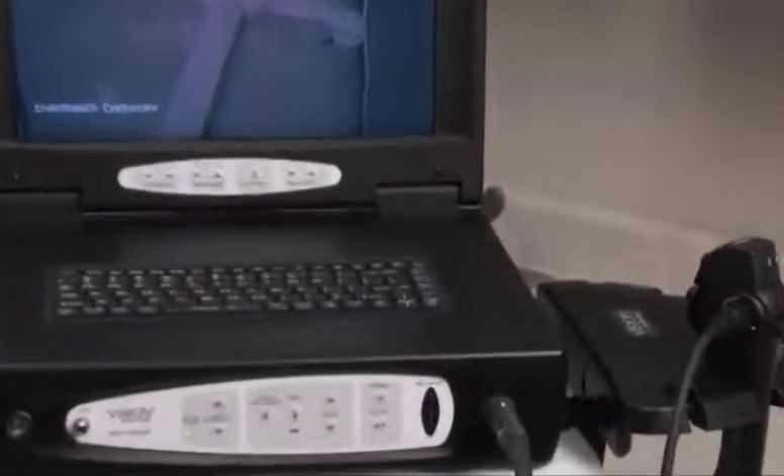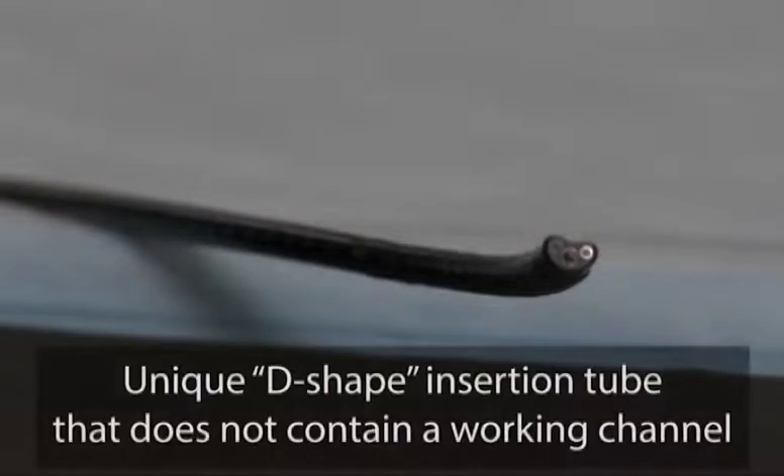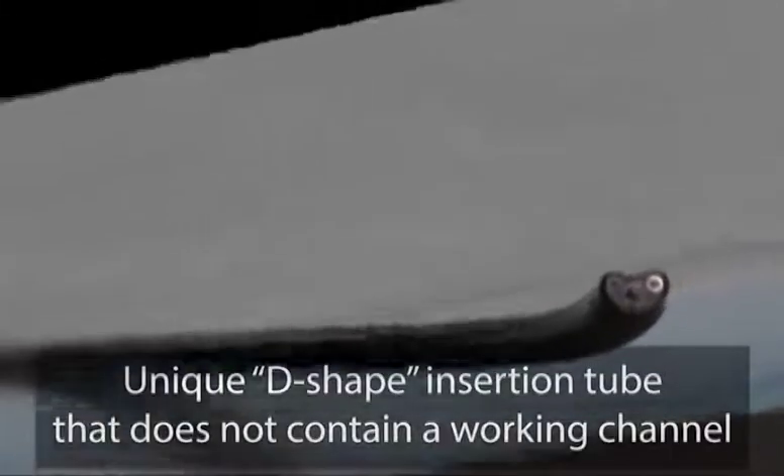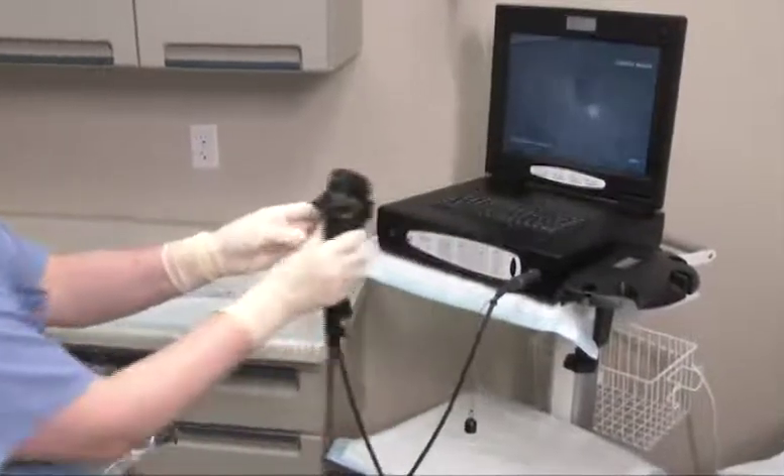The CST 5000 Flexible Cystoscope contains image and illumination features like other cystoscopes, but unlike conventional scopes, the CST 5000 has a unique D-shape insertion tube that does not contain a working channel. Instead, the CST 5000 utilizes the patented Endosheath technology — a sterile disposable sheath that fits snugly on the scope, providing a barrier between the endoscope and the patient.